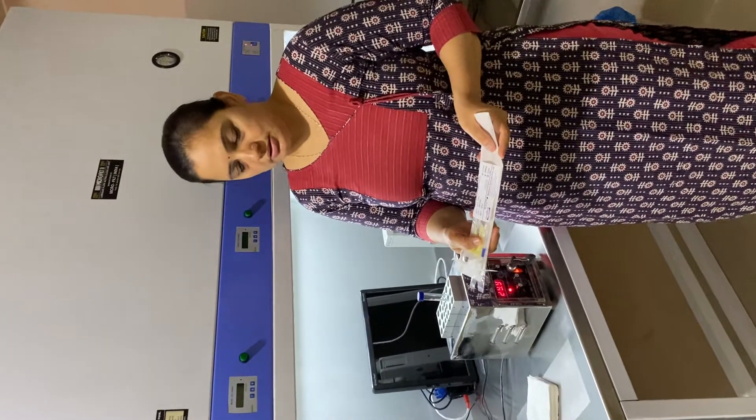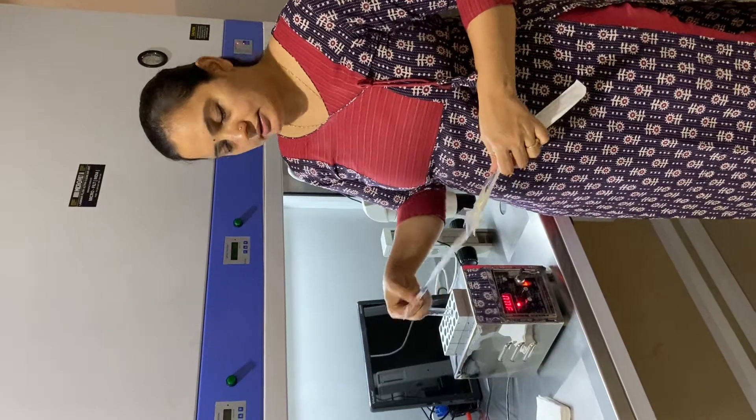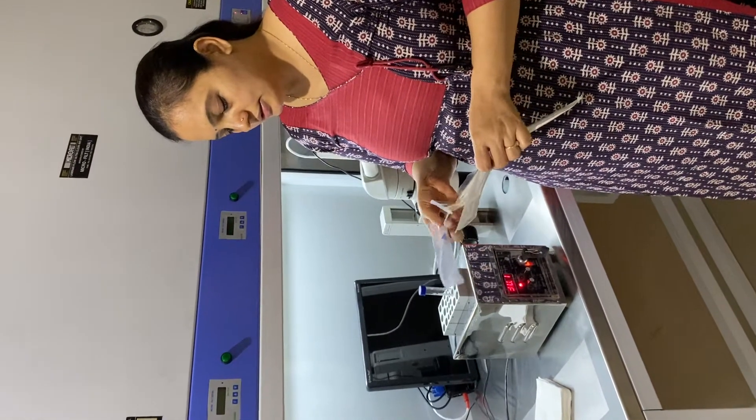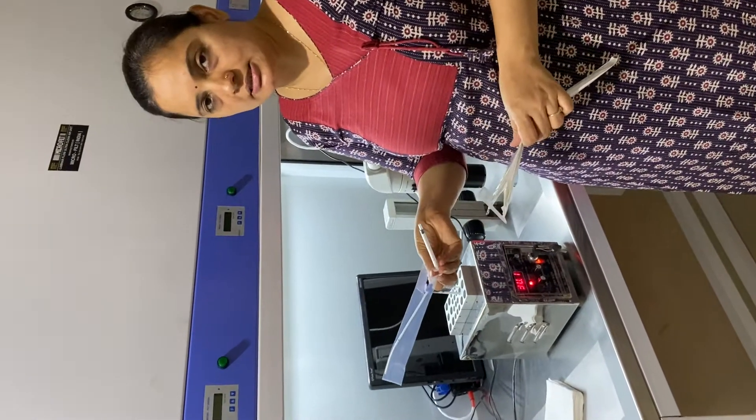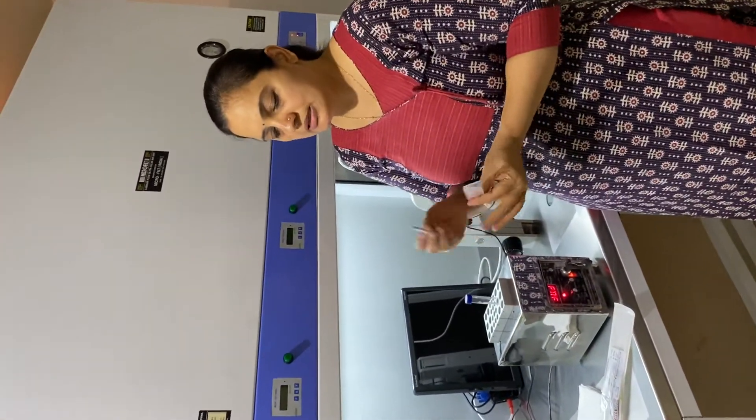This is the IUI cannula. Now, with the IUI cannula, we also have a 1 ml PD syringe. So what I am going to do is show you how to create air vacuum.